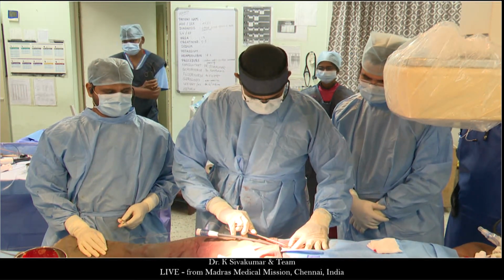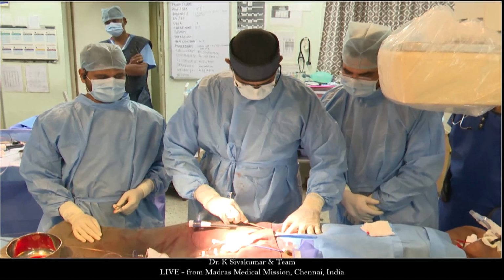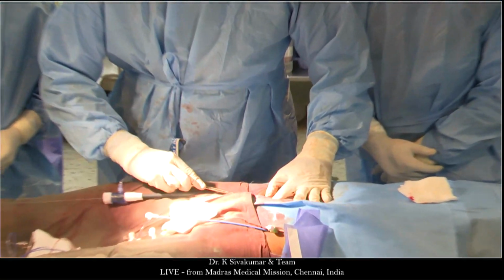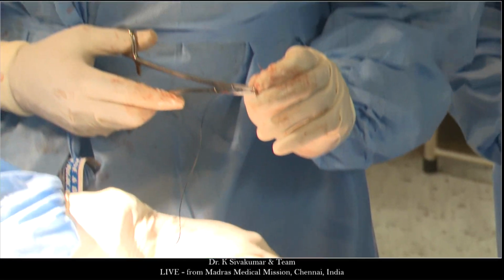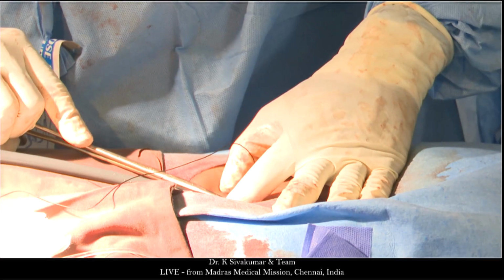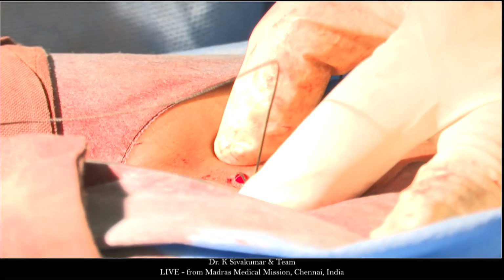Great. Siva, regarding the ASD, is there a particular sinus venosus ASD that you say it's either too big or relatively low that you will say, I can't do it? Does the ASD affect your decision on whether it's doable or not?